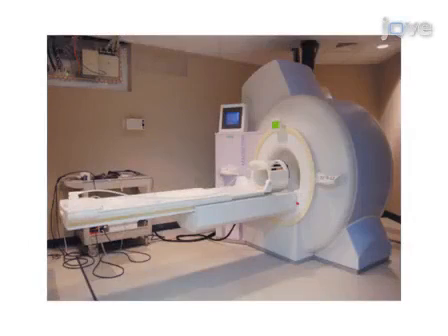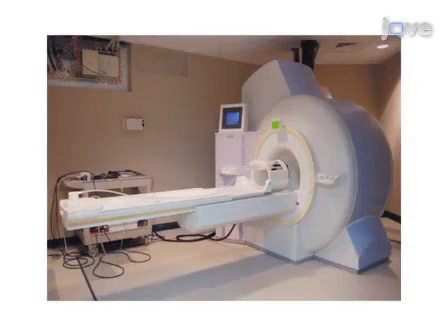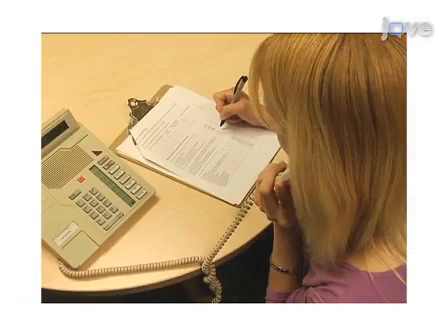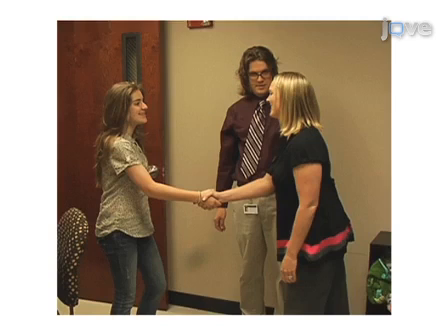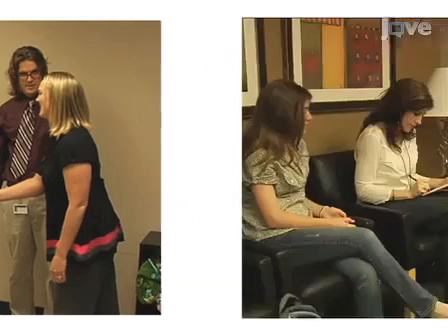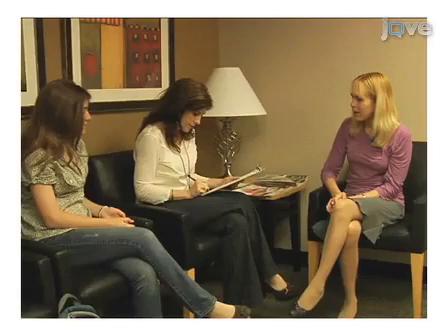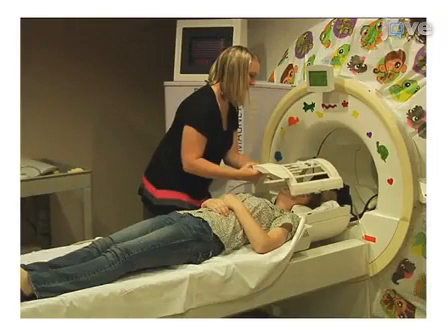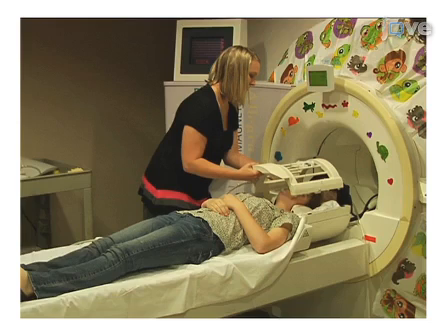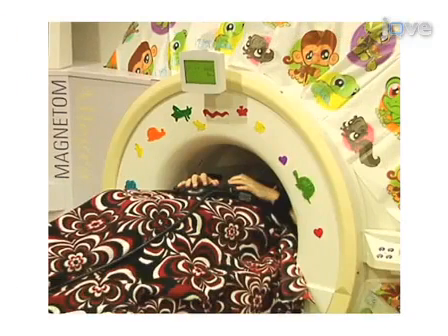This is achieved by designing appropriate fMRI experiments, then recruiting autistic participants. The participants must be adequately prepared for the procedure to obtain quality functional and structural brain images. The functional experiments are presented to the participant in the MRI scanner while performing a predefined task.